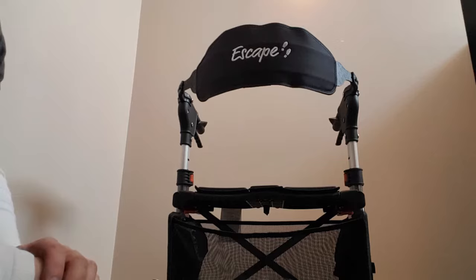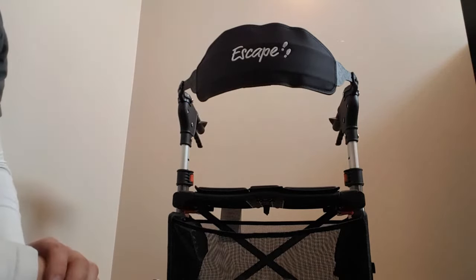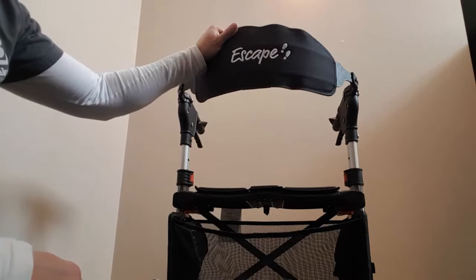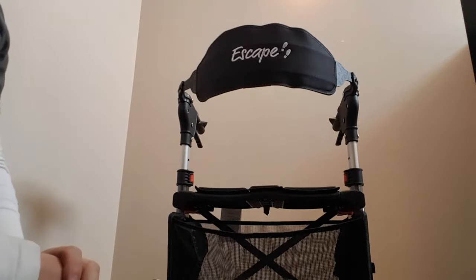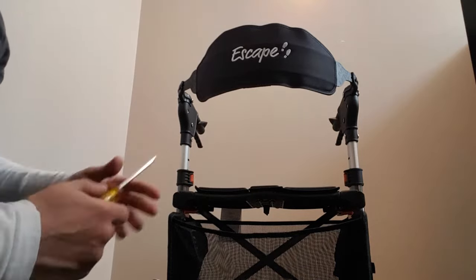Thanks for checking out lifemed.ca. I'm Mike Dangerfield and as you can see I have the Escape Walker from Triumph Mobility and we're going to feature this new backrest that they put on it. There's been quite a bit of thought put into it in terms of its design and some features that some other manufacturers haven't even thought of yet.